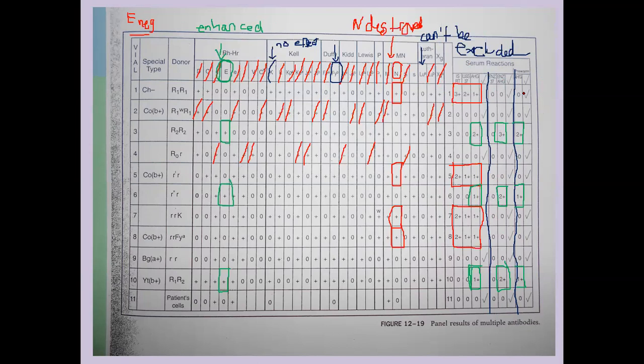We did the pre-warm and repeated the original panel because we wanted to see if this anti-N was clinically significant. If it reacted here at 37, we would have to consider it for transfusion purposes. It did not. So what that leaves us with is the patient has anti-E, and they should be provided with E antigen negative donor cells so they do not have a transfusion reaction.